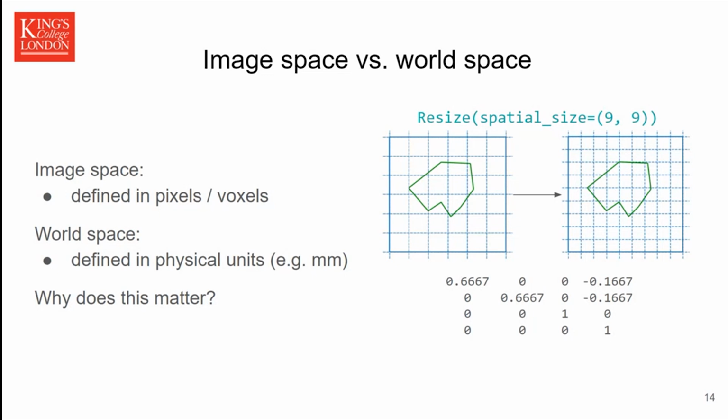If we resize an image from one set of pixels to another, then we actually get this affine transform that is generated on the tensor, which represents the scale that we performed to the grid in order to create the description that the grid resampler uses to resample this data, or the interpolate backend uses to resample this data. Why does this matter, I hear you ask?